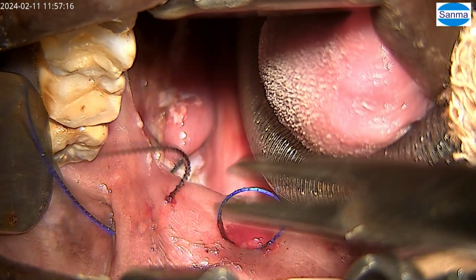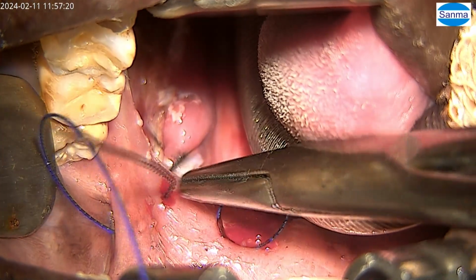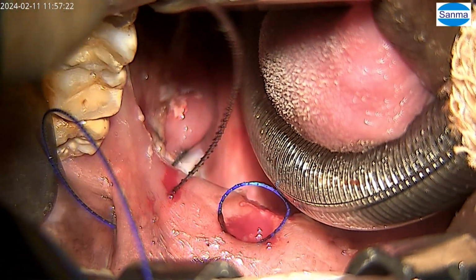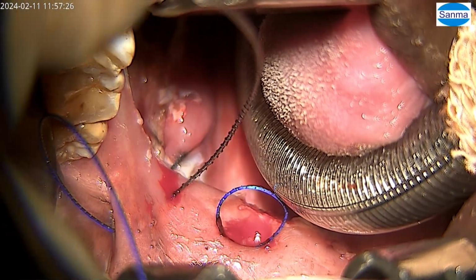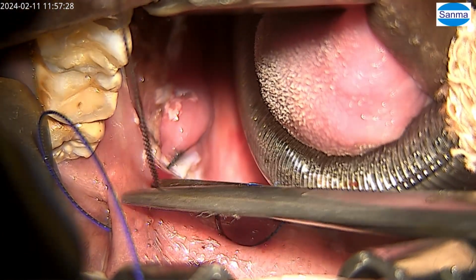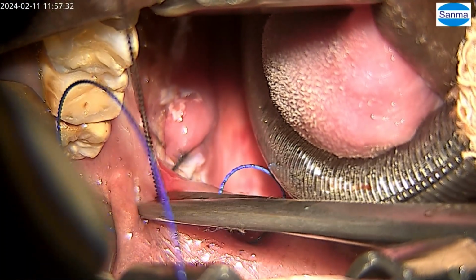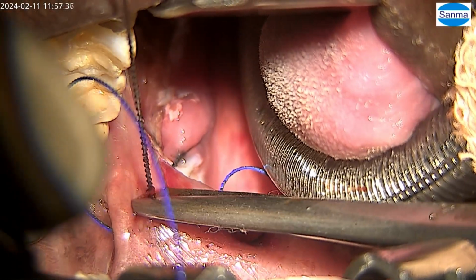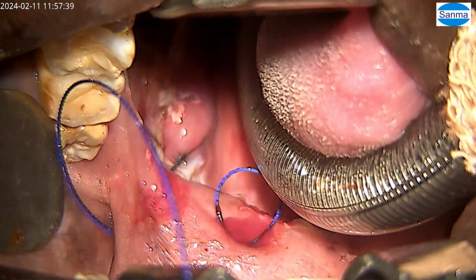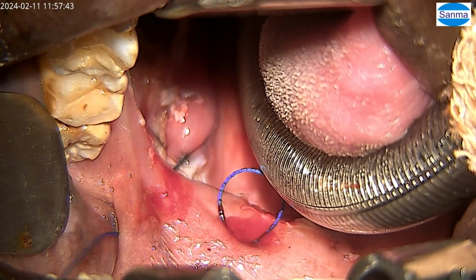So then I came back, and I have just taken a U-turn so that it does not open up. Scissor please. So the absorbable suture I have done on the right, done on the left, U-turn and cutting it over here. No, this suture is not cutting. Scissors. All right. So now this suture will remain in its place.